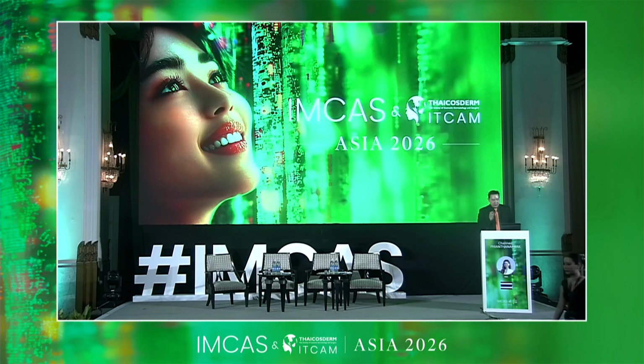In terms of medical practice, we can adjust the parameters of the machine, because maybe some patients can tolerate more energy or more pain, since the pain sensation or pain threshold is very individual. But you should ask your patient to grade the pain. And as Dr. Anna said, maybe in some cases patients cannot tolerate even a small energy.